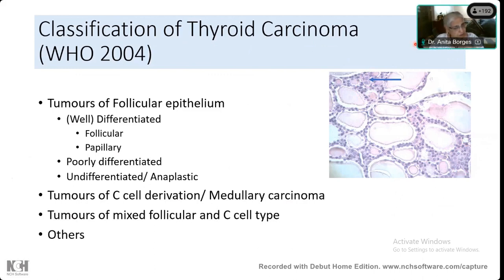Oh, what will it look like? It will look round. Linear. It'll look like a sheet. Look at this, where you see my cursor going. Okay, that is the top that has been chopped off from a sphere. So when you have a sphere and you pass your knife over the top of a sphere, that's what it will look like. And many students mistake these for C cells. Okay, that's nothing but the edge of the top of the sphere. So that is what C cells are not.